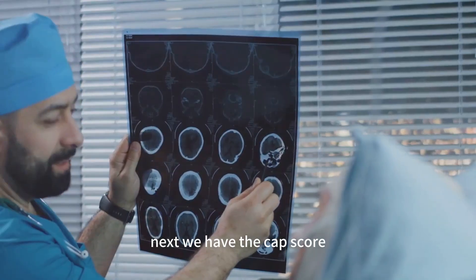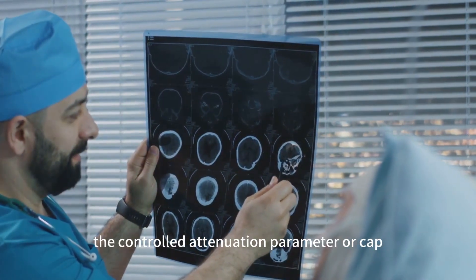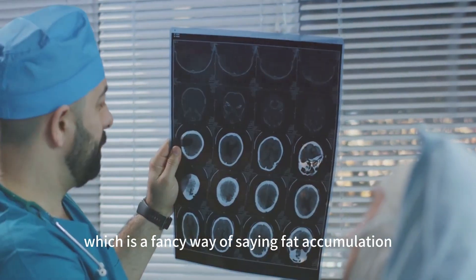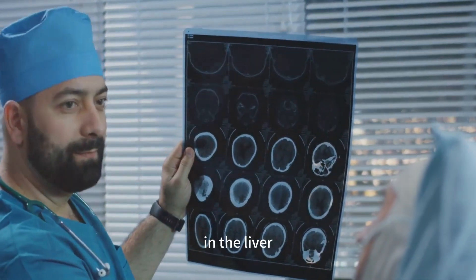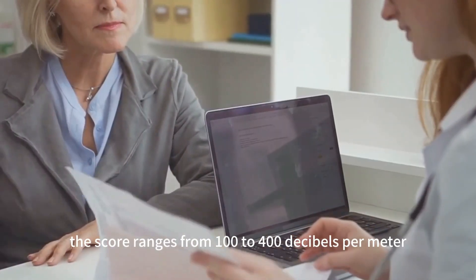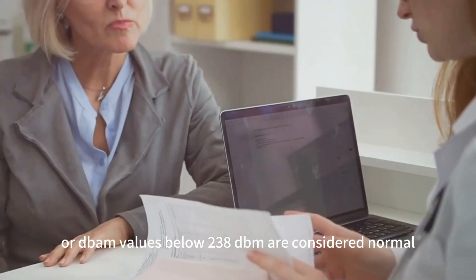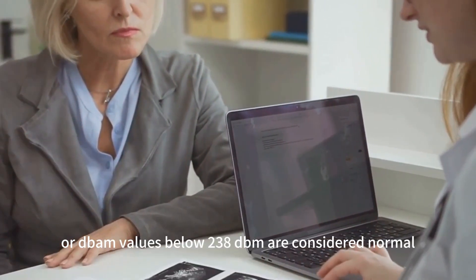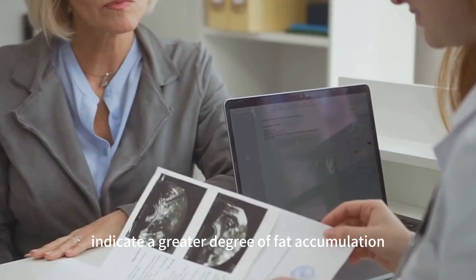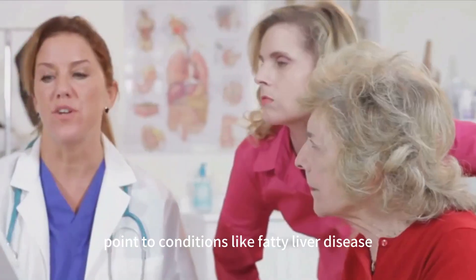Next, we have the CAP score. The controlled attenuation parameter, or CAP, assesses the degree of steatosis, which is a fancy way of saying fat accumulation in the liver. The score ranges from 100 to 400 decibels per meter, or dBm. Values below 238 dBm are considered normal. Higher scores indicate a greater degree of fat accumulation, which could point to conditions like fatty liver disease.